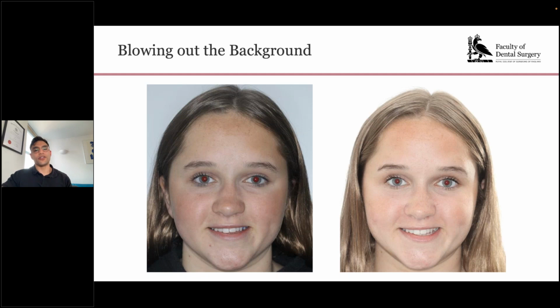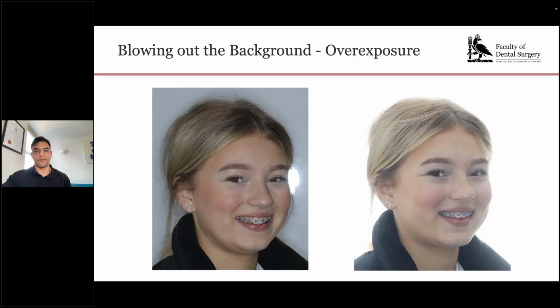And a final thing you can do, if you're taking a photograph where the overhead light for the chair is nearby, is shine that near to the direction of the patient. Make sure you don't get it in the photograph, and that will make the eyes constrict and diminish the red eye. You can use post features as well, software to remove red eye, but that's onerous because you've got to do it for every photograph.